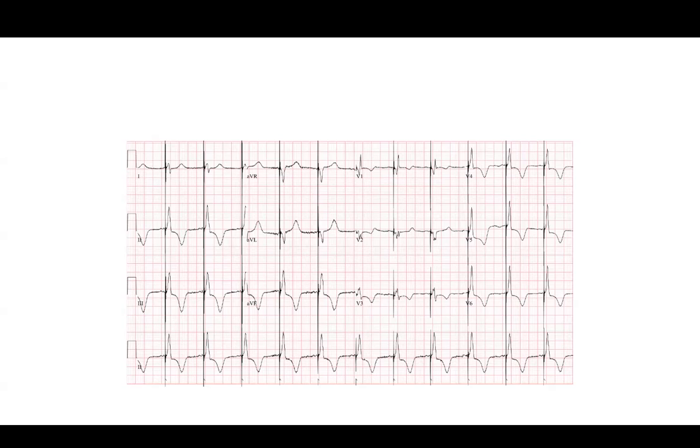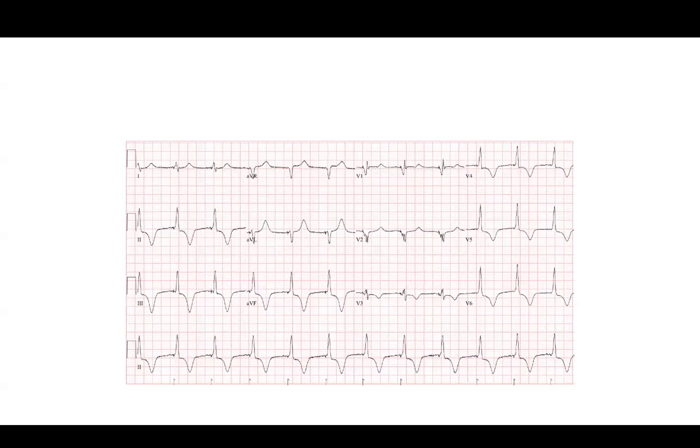But I find even when there's the anodal stimulation, is it really better? I find that sometimes yes, sometimes no. Sometimes the total QRS duration I find doesn't change that much. It's just the beginning of the QRS that's different. I think here it changed beautifully, so I guess it depends. It's for a different reason. It's not because of anodal.